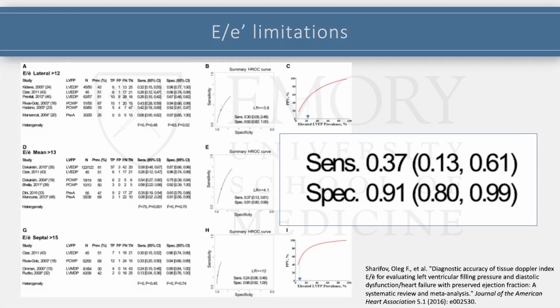I think appropriate application of these measures is the key for getting a reliable reading on diastolic function when you're doing an echo assessment. So as interesting as this is, it has really poor sensitivity, maybe not so surprising, because we're pooling a lot of unrelated patients and it doesn't tell us much about who it works for and who it doesn't. All of these patients, by the way, had preserved EF.